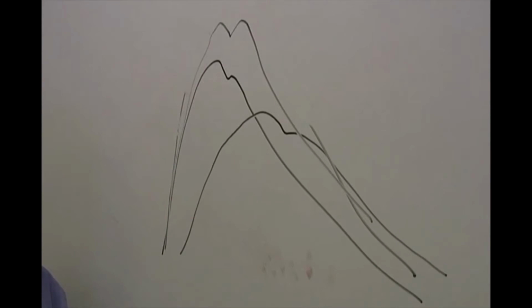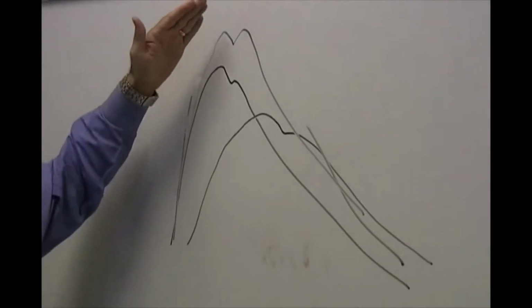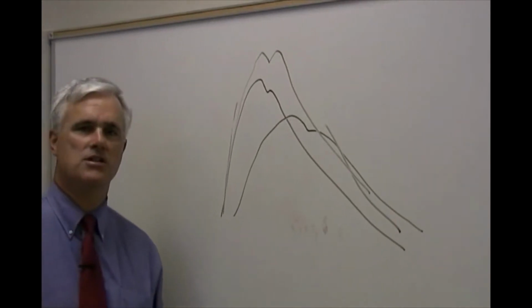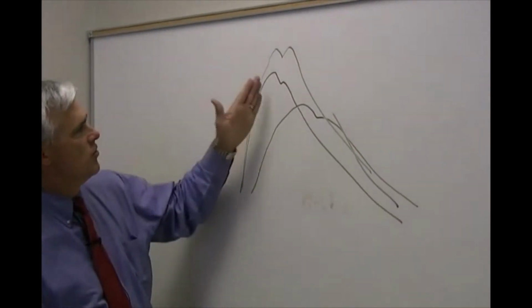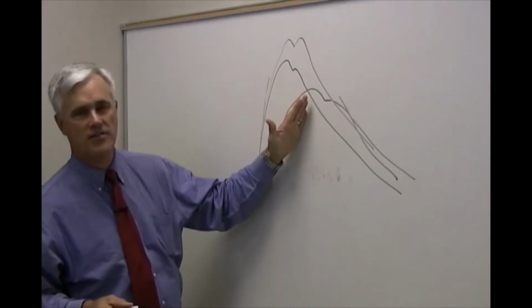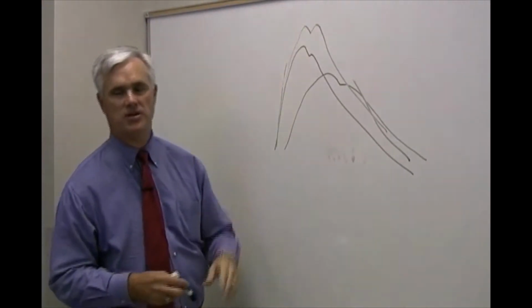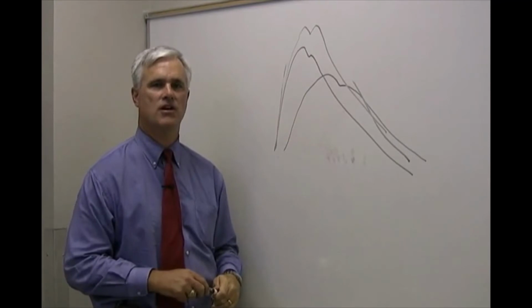But a double pulse or a bifid pulse occurs in patients that have a hypertrophic cardiomyopathy. Their pulse goes up, they have an obstruction, they overcome the obstruction, and then have a second pulse. So you can have normal pulses, parvus et tardus pulses, water hammer pulses, or bifid pulses, and we'll try to show you all those on the Harvey.